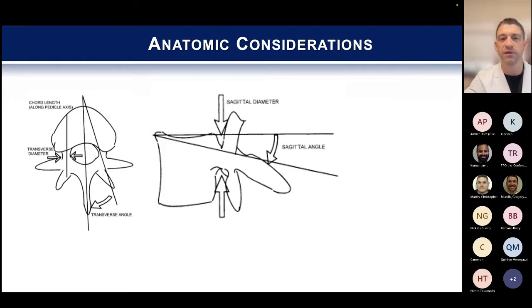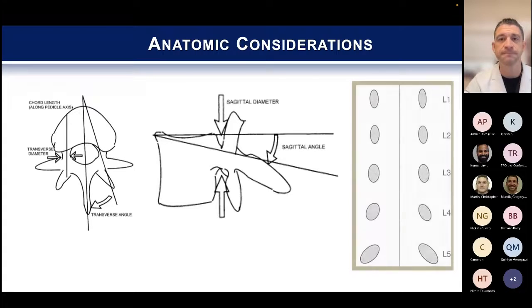And then again, just having good relational anatomy, I think is really important, that you know where things are. Something to always keep in the back of your head, like the bad area is medial and inferior. That's where you don't really want to miss. And so if you're going to miss, you want to miss high and lateral. So that's the ticket there.